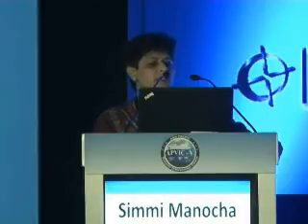It is a higher frequency probe. Generally, we use 7.5 megahertz. It is better for superficial structures and vessels. It generates rectangular images. It has good resolution and lesser penetration.